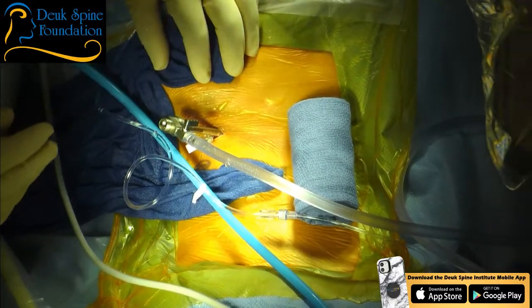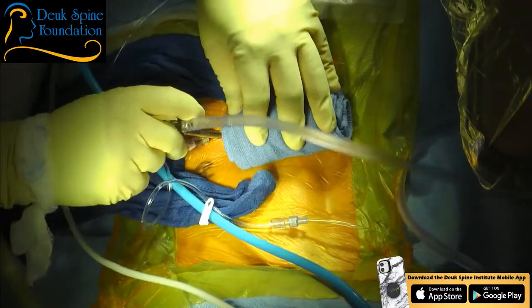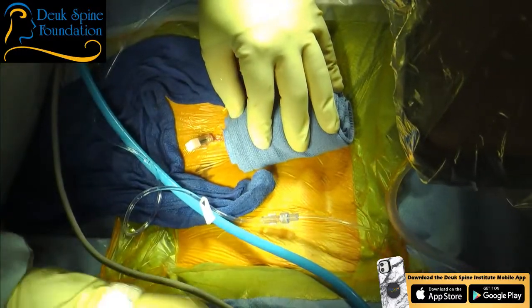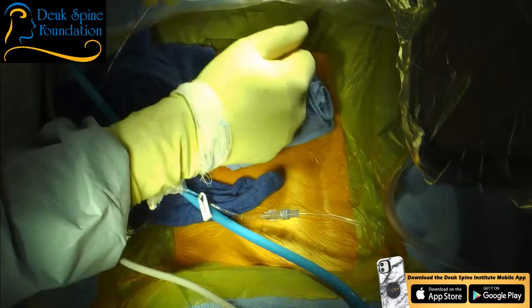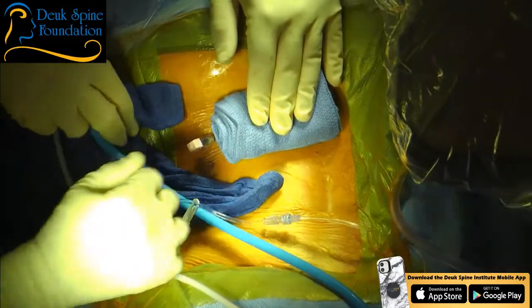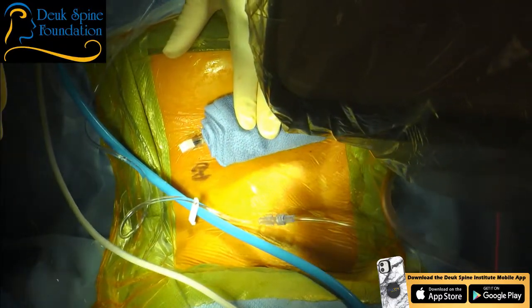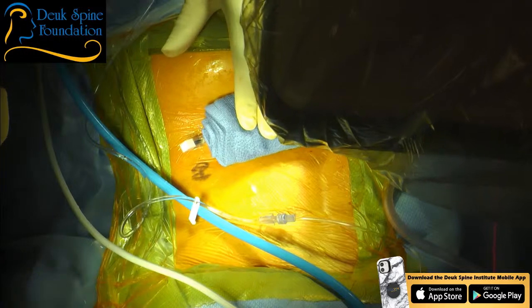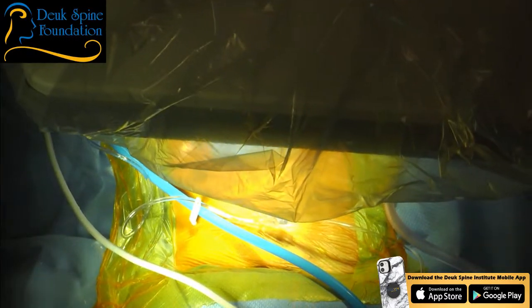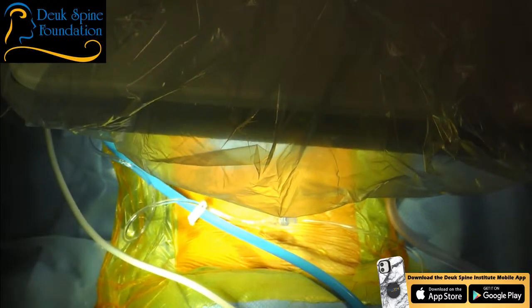Normally we put a little bit of steroid to reduce some of the irritation of the nerves and stuff that we are treating right in that area, but we can't do that. This patient, unfortunately, has apparently a reaction to the steroid. Go ahead, watch. You've got to move your face away. You cannot stand there and let somebody do that, okay? So go ahead and get the fluoro in.